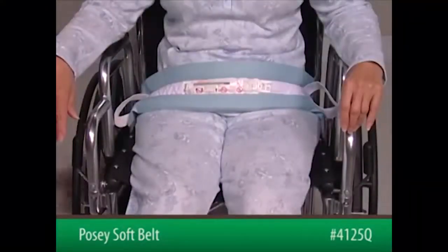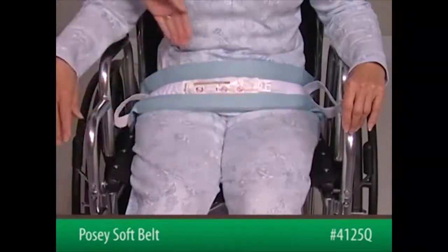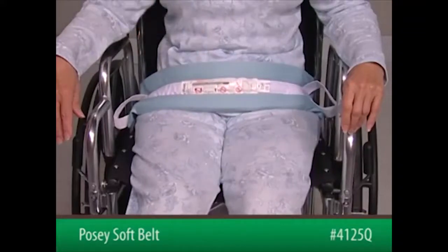After connecting the straps to the back of the wheelchair, slide an open hand flat between the device and the patient to ensure proper fit. The device must be snug but not interfere with breathing.